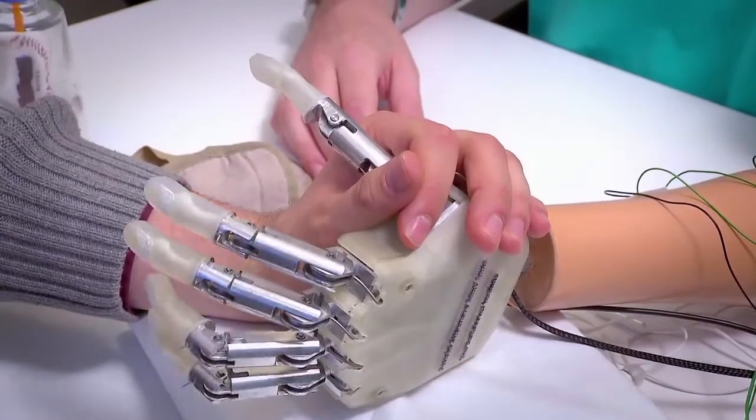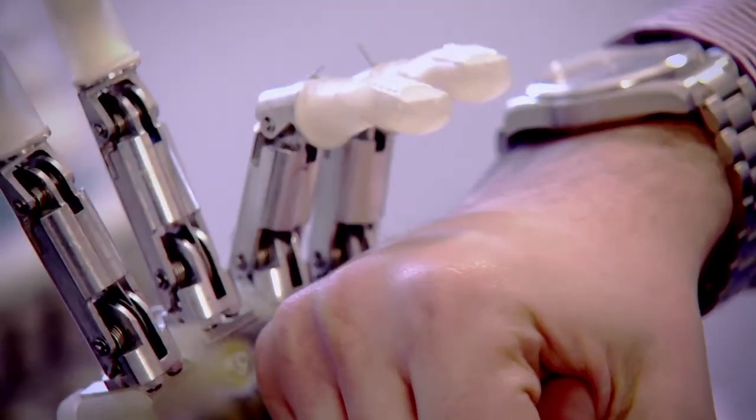The next step is to improve the sensor capabilities of the hand and improve the intelligence on board the hand in order to make the hand more and more autonomous in performing the task.